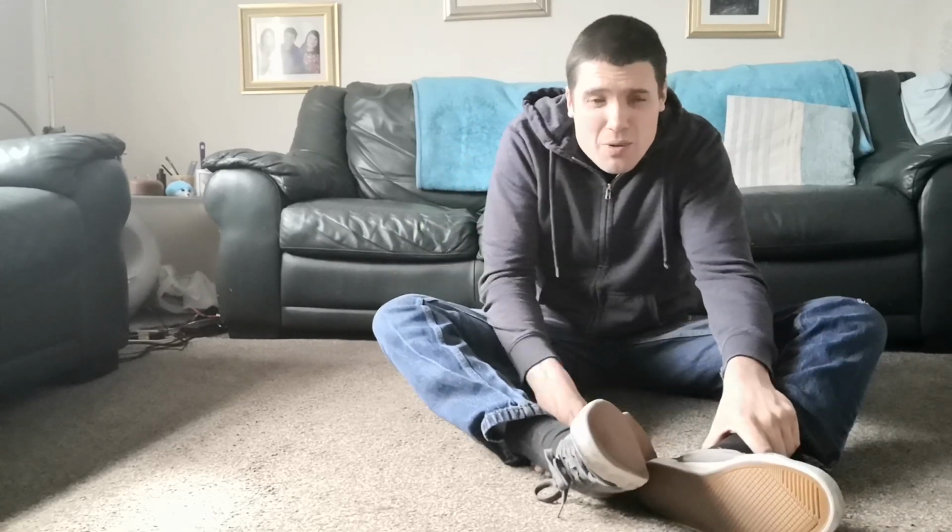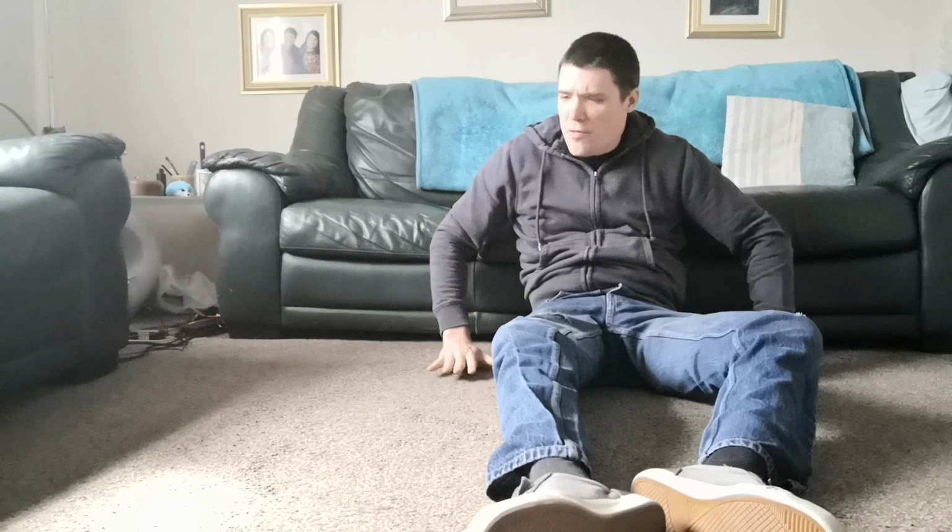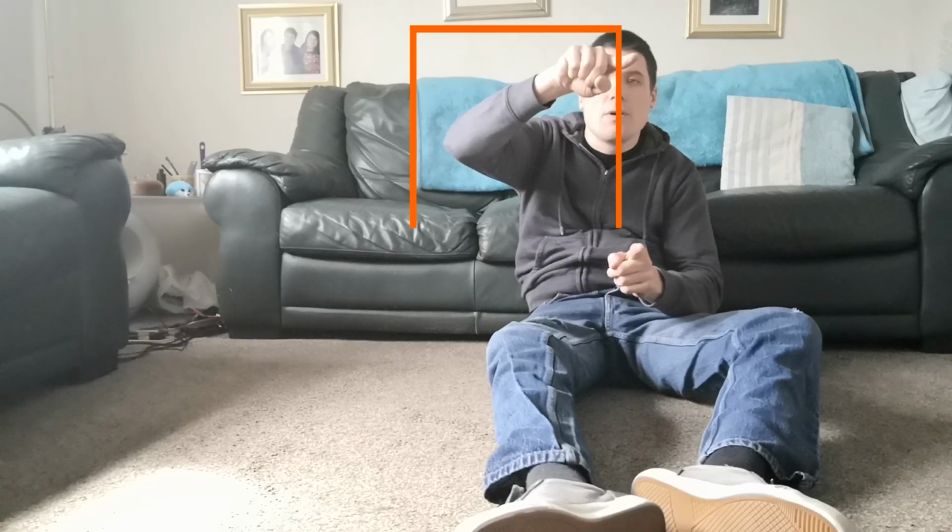The technique I see a lot of people doing, which I really don't recommend, is sort of a bell curve transfer, where they're thinking of going across to where they want to be, but that's all they're seeing. What you need to do is a square one where you lift up, move across, and then down. Really think about this when you're doing this kind of maneuver: think up, across, down. Be very conscious of it.